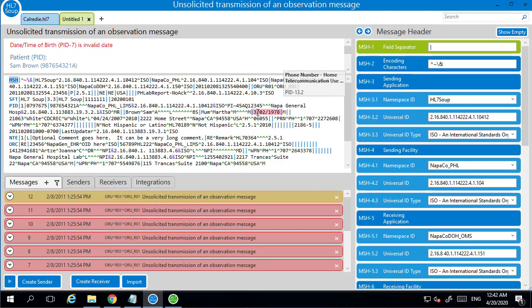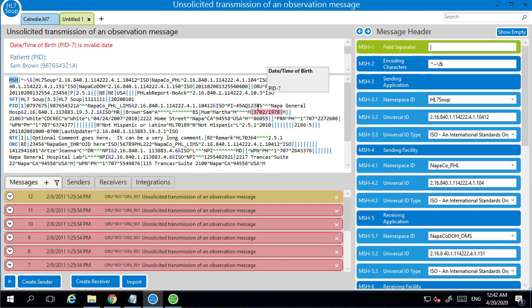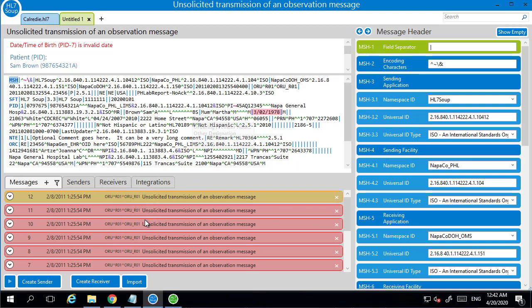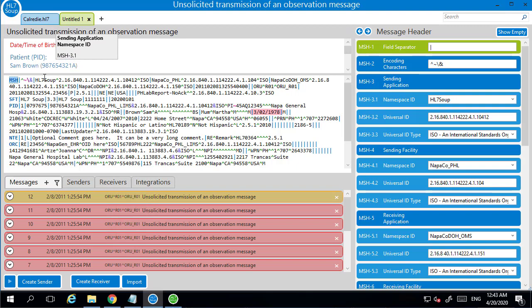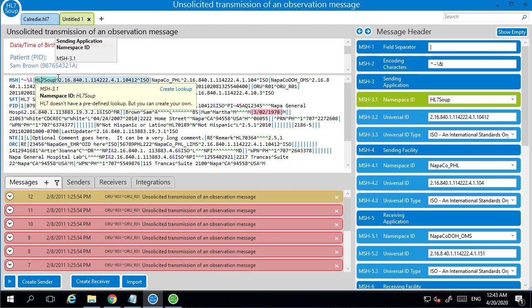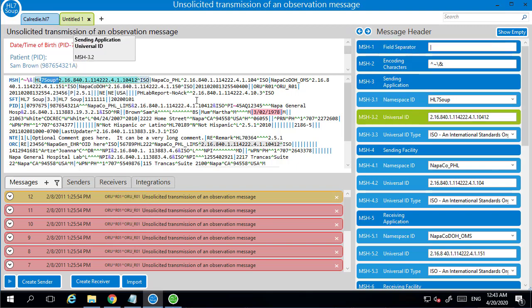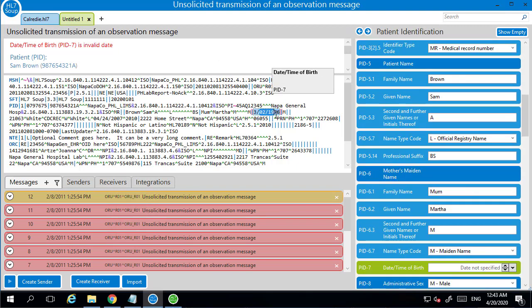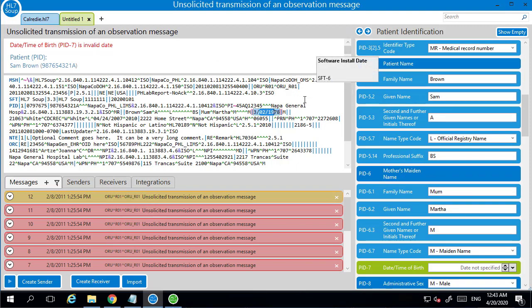We can see all the messages are there. There's an invalidation in them. That's because I didn't convert the date, they were a different date format. Again, look at those other videos for the details on how to do that. But as a general rule, you can see what we've done is we've created an HL7 file that our literal values are in each of the records, and our values that we have from our system have been mapped into those fields too.